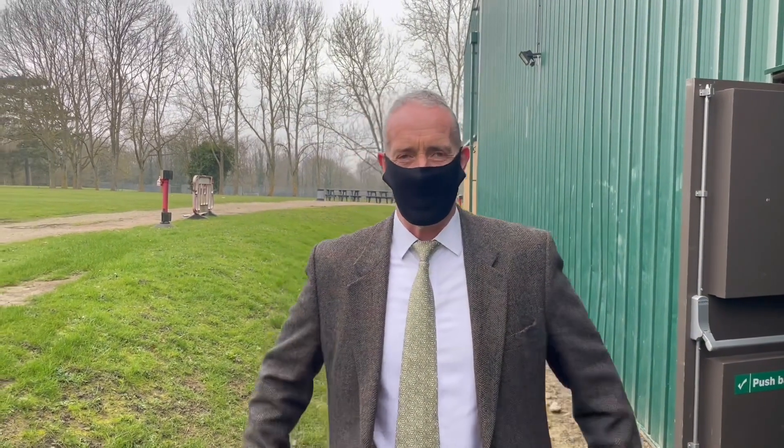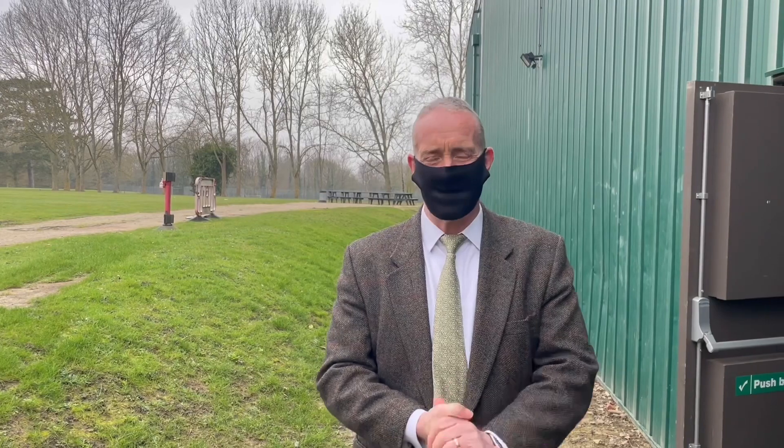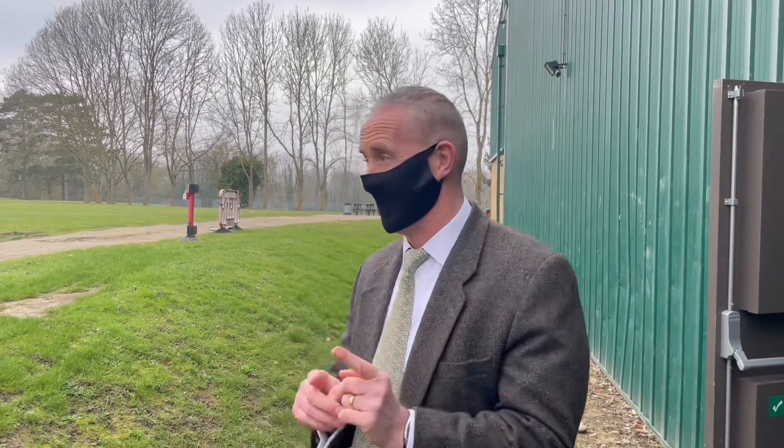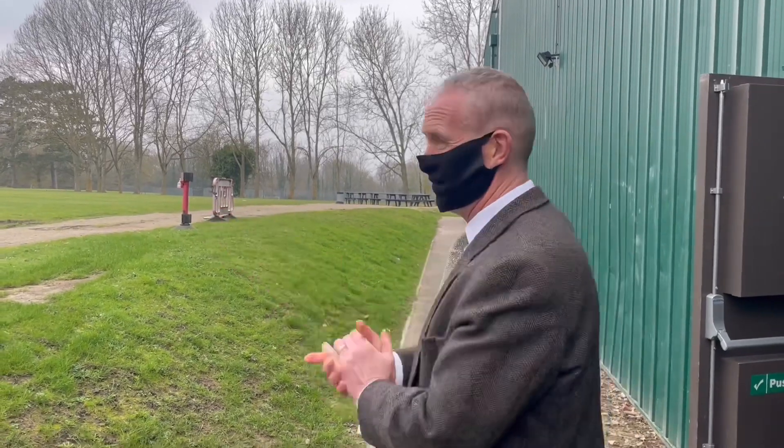Well, here we are again everyone, just about to come back to school which I'm delighted about. We are putting this video together so that you know exactly how we're going to go through our lateral flow testing. Whether you're aware or not, we are going to test you three times when you come back to school and then you'll be doing some testing from home. This video is about taking you through the process of how you're going to lateral flow test within school, and we are starting at the back of the sports hall.